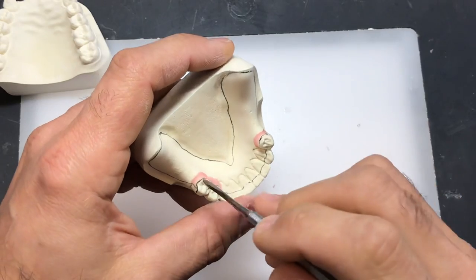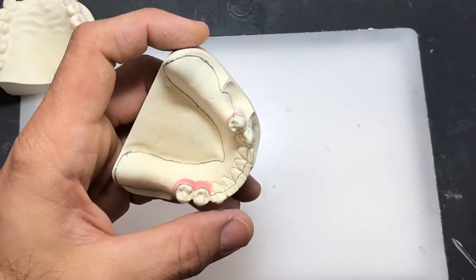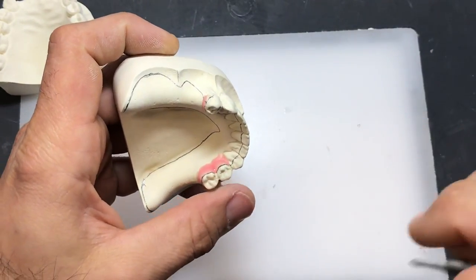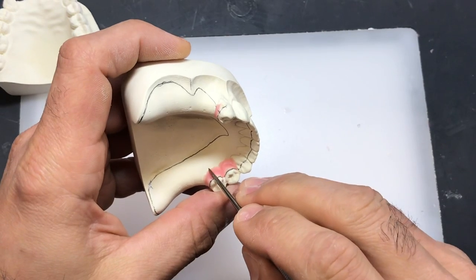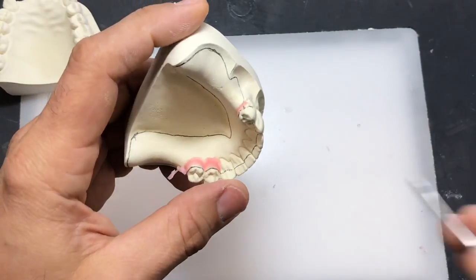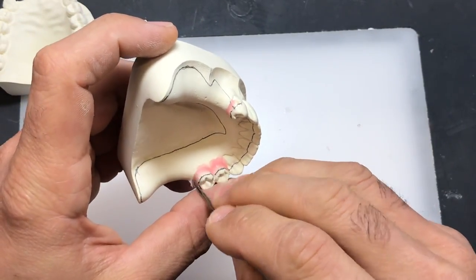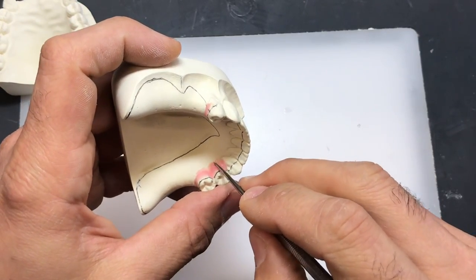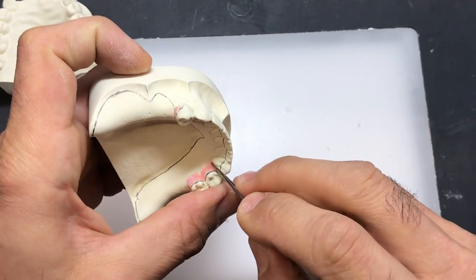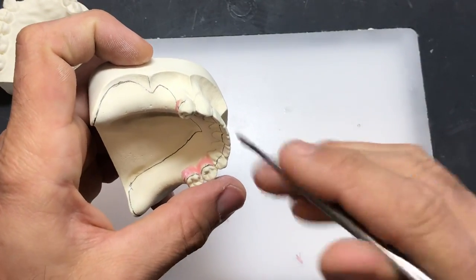It is a lot easier to do this when the models are dry, like these are here, so the wax can adhere to the model surface. I'm going to heat up my number 7 spatula and go back and trim back or carve back the excess wax. You have to be a little creative here and imagine the path of insertion. If you're going to err on the side, have a little bit too much block out, but certainly keep the wax below the pencil line.